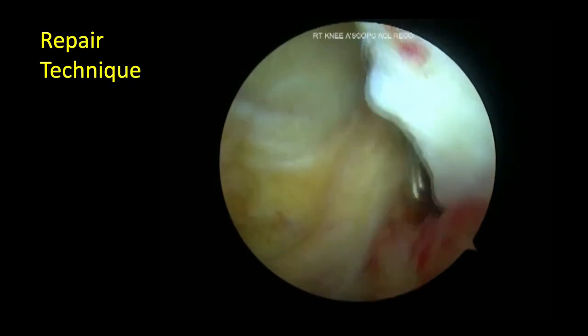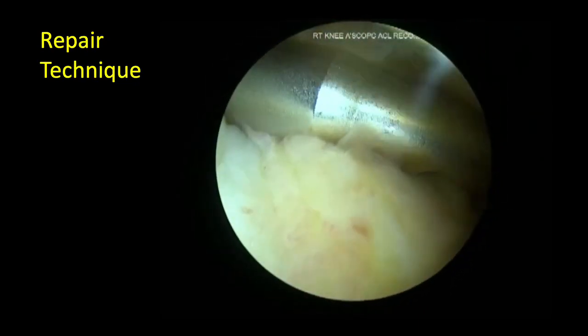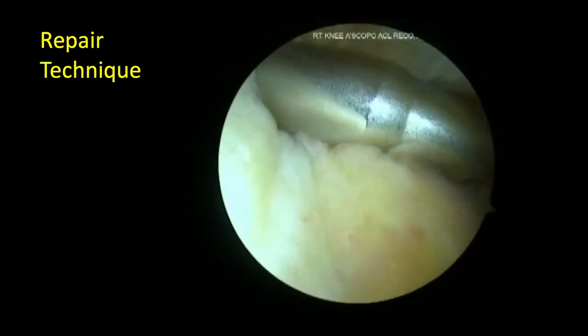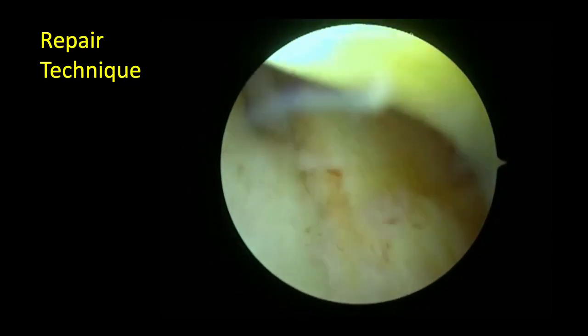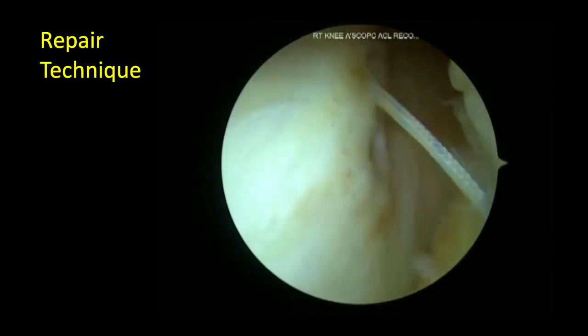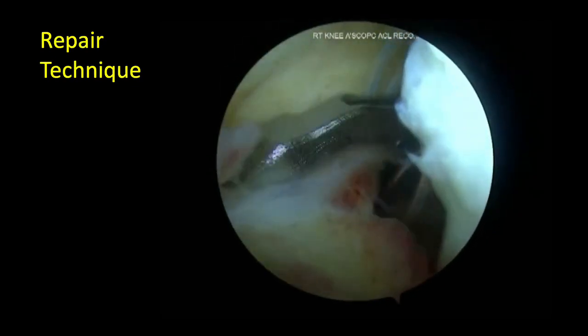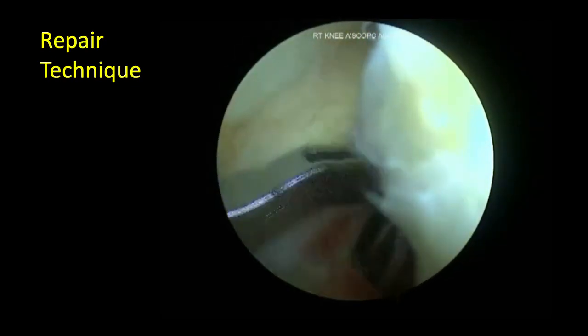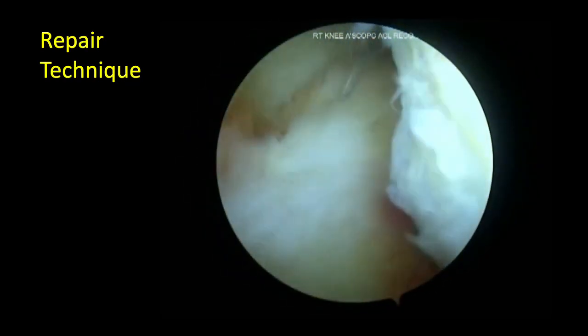rasping of the torn edges with a diamond rasp, followed by insertion of 1.7 mm drill sleeve for insertion of all suture anchor. The suture anchor is deployed in the previously drilled hole. One suture is loaded on antegrade suture passing device and a bite is taken through the full thickness of posterior medial capsular structures including the meniscotibial ligament.